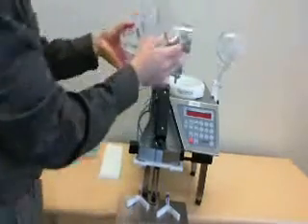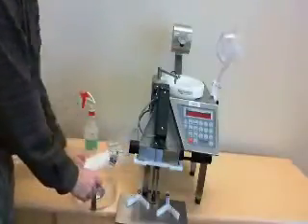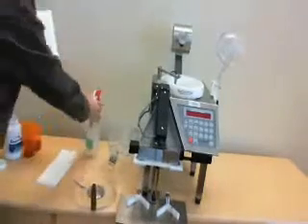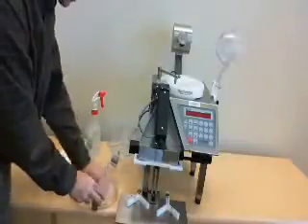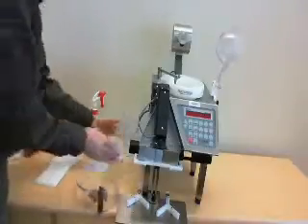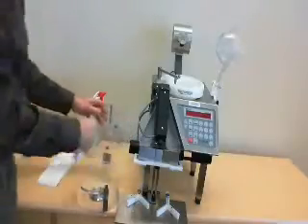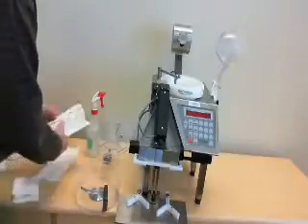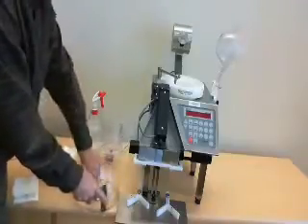We'll start with the feeder. This opens, again with this spring mechanism. We recommend spraying onto a towel versus directly in. You're able to control the amount of cleaning solution you're using. For the purpose of brevity, I will make a relatively quick clean off of this. But you're going to want to get all surfaces that touch medications, and then use a dry towel or dry cloth afterwards to ensure that there's no moisture or residue.